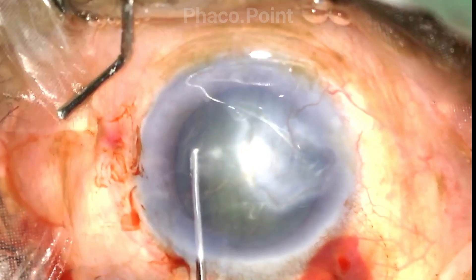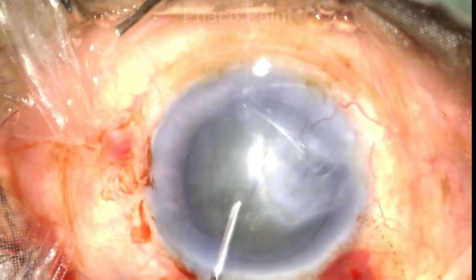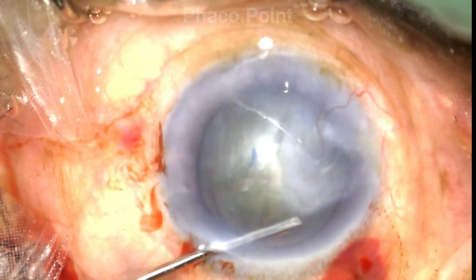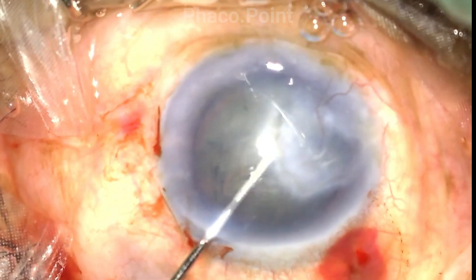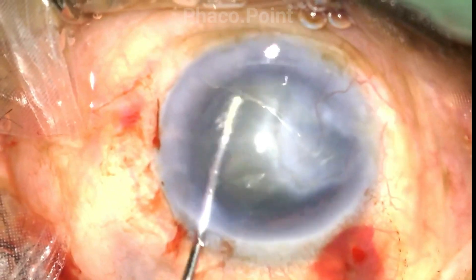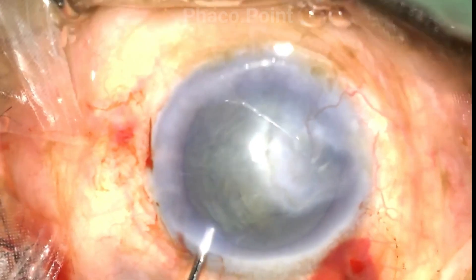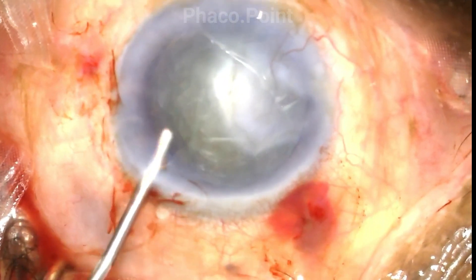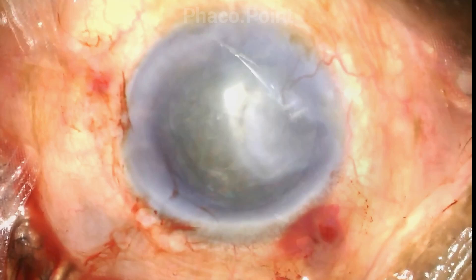In this case you can see the hydrodissection wave on the left side, but on the right side it's going to be quite challenging to visualize the wave. So what you go by is seeing the nucleus rise and the overall rotatability of the nucleus, which should confirm that hydrodissection is complete.